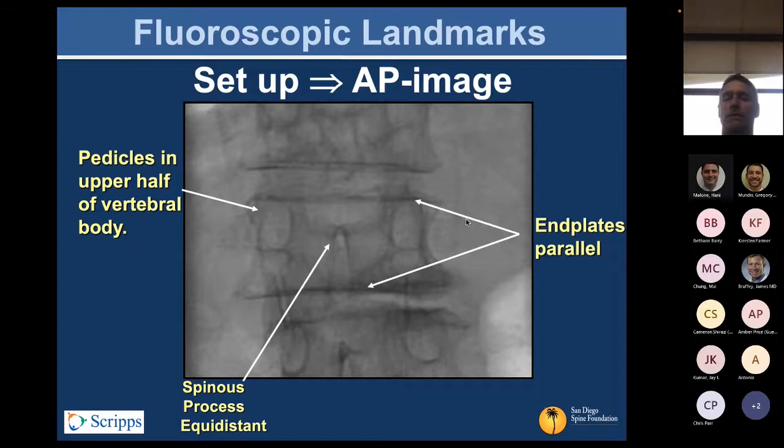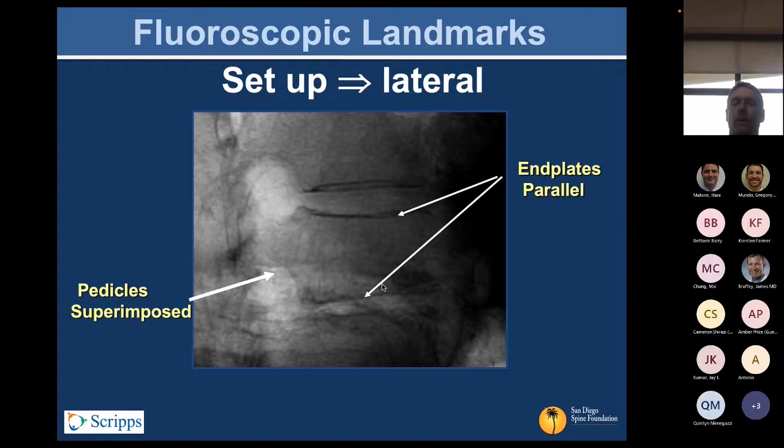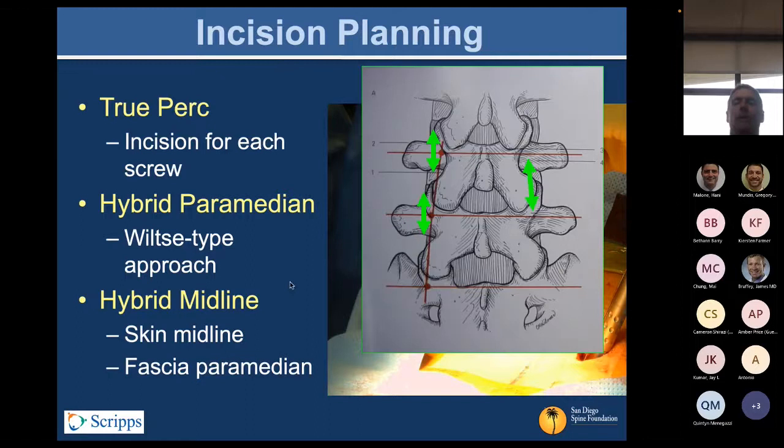Ultimately you want to find good AP views of the vertebra so that the spinous process bisects the interpedicular distance. Generally that's the kind of look you want — parallel end plates above and below — so you have a true AP of the vertebra. On lateral, you also want nice on-face profile views of the end plates, and ideally with the pedicle superimposed. These are all important perspectives, whether it's a PERC screw or even a lateral interbody.